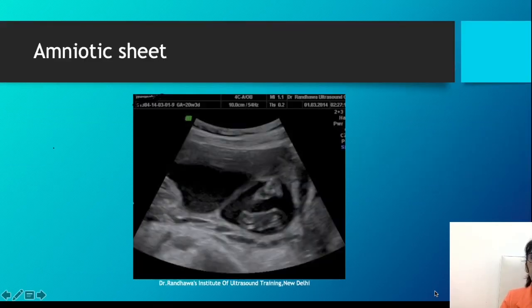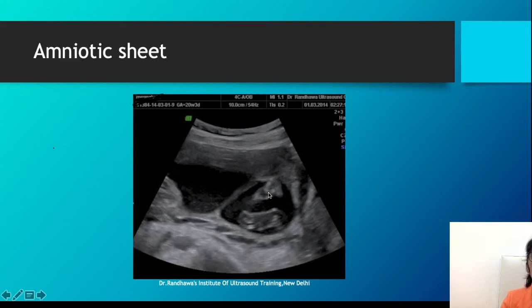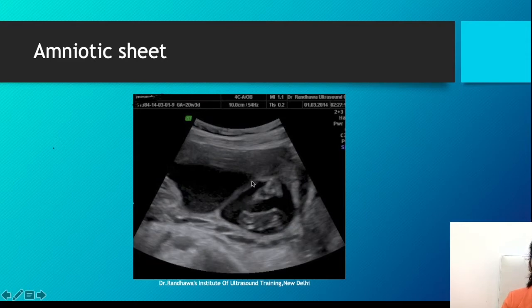Looking at this picture of a transabdominal obstetric scan, we can see placenta anteriorly, the uterine wall, and a sheet-like membrane crossing the amniotic cavity anterior-posteriorly. Its base is a little broad on one side and not as broad on the other. It is a thicker membrane going anterior-posteriorly across the amniotic cavity - this is an amniotic sheet.